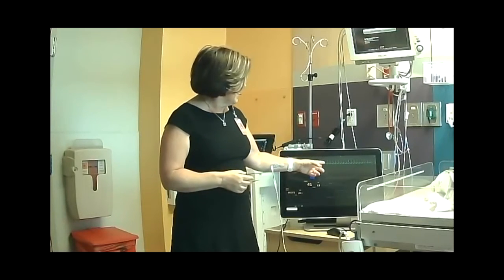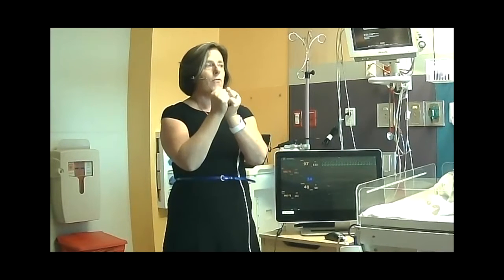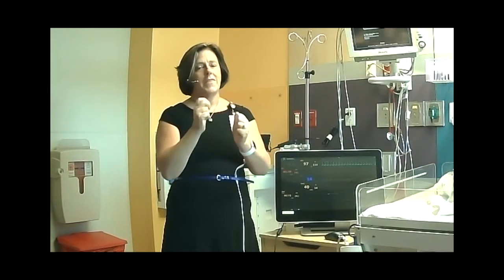The second is the bottom two chambers, or the ventricles. If the ventricles fire together, you'll see a nice tall waveform that's thin. Okay, so you want it nice and tight. We call it the QRS. So it's nice and tight. That means the ventricle is squeezed. That's what you get when you feel for a pulse, the ventricle squeezing and giving blood out.